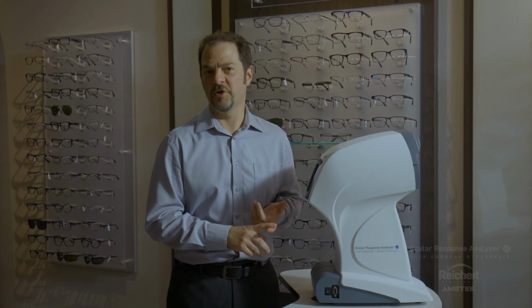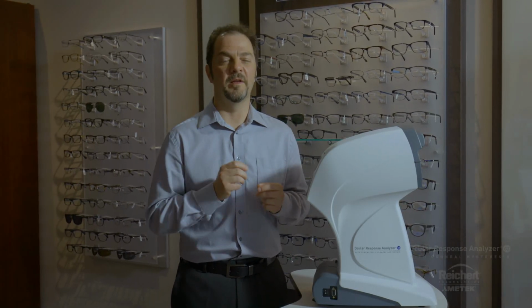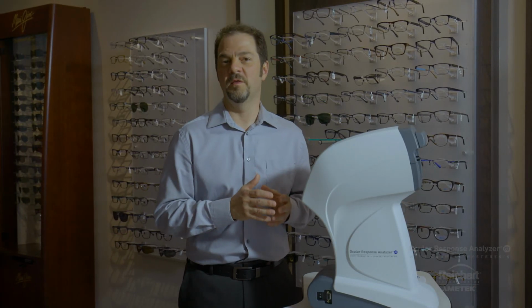So this subjectivity of Goldmann tonometry has lulled clinicians into a false sense of IOP symmetry between the two eyes over the years. But what we've learned in recent studies, including implantable pressure transducer studies in primates and other things of that nature, is that the intraocular pressure fluctuates much more dramatically and also very rapidly than we have previously appreciated. So it's not unlikely to actually have a pressure difference between the two eyes. Could be related to the ocular pulse, or it could actually be a pressure difference between the two eyes.